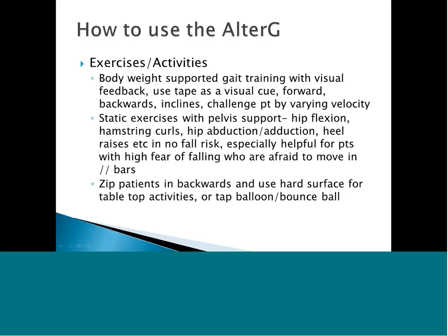One of the success marketing stories that I had just recently is I took this presentation to the cardiopulmonary rehab department at Akron General and incorporated it with our Cardiac 360 program that we have here. So a lot of cardiologists were sending in patients that they just want to have lose weight so that they can get into surgery. Cardiovascular physicians are using it for their patients.